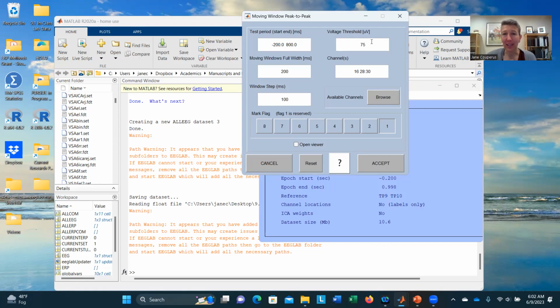I'm also going to set a threshold again now of 75. And now this is just the voltage threshold. It knows it's 75 on either end, and actually a total of 75, I should say. And then it has a moving window of 200. You could set this to 100. You could set this to 300. It depends on how long you want that window to be. And the step, how much time is it moving along? And so 100 is generally fine.